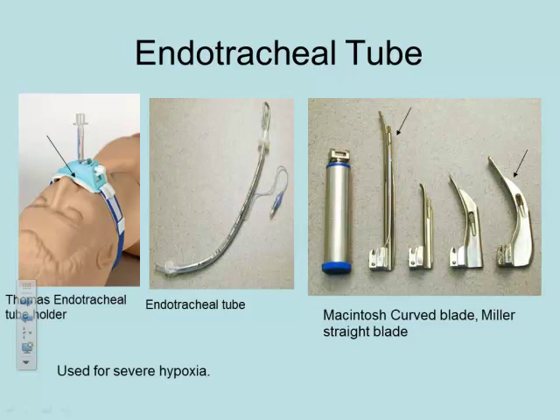And the big items that I want you to remember is the difference between a low flow device and a high flow device for the quiz.